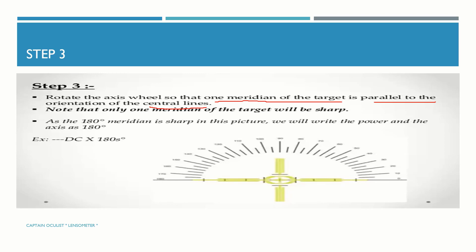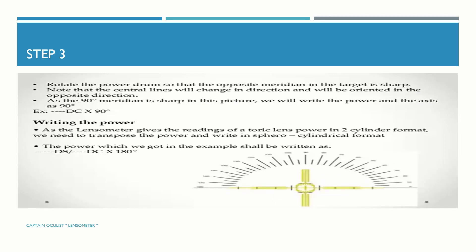Note that only one meridian of the target will be sharp. As the 180 meridian is sharp in this picture, we will write the power and the axis as 180 degrees. Then rotate the power drum so that the opposite meridian in the target is sharp — note that the central lines will change direction and be oriented in the opposite direction. As the 90 meridian is sharp in this picture, we will write the power and the axis as 90 degrees.